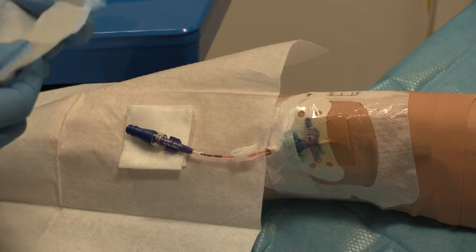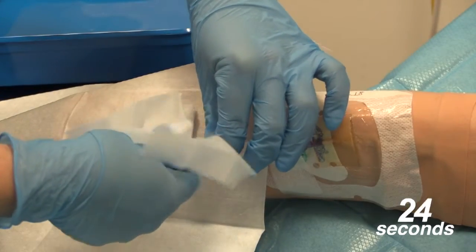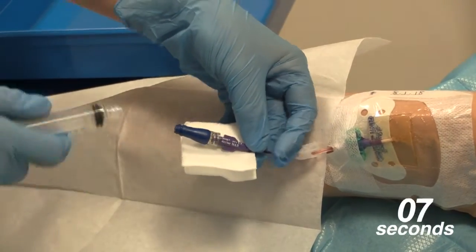Using the whole of the Clinell device wipe and the scrub the hub technique, clean the needle-free valve for at least 30 seconds. This then needs to be allowed to dry on some fresh sterile gauze for another 30 seconds.